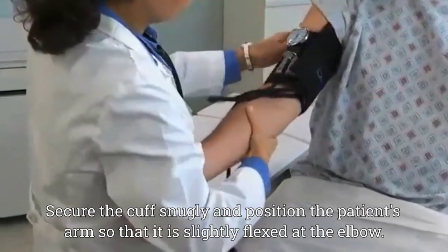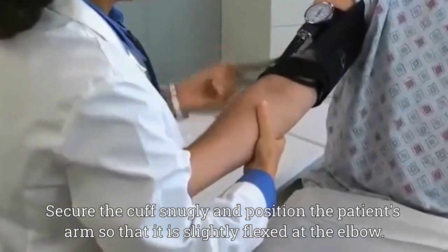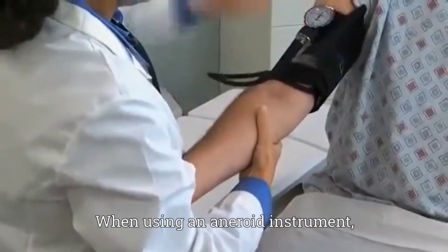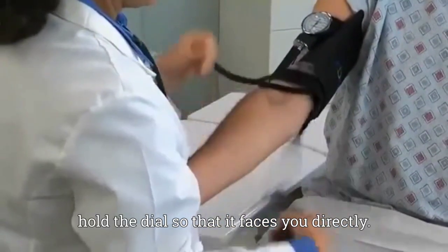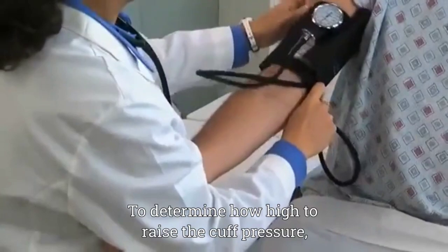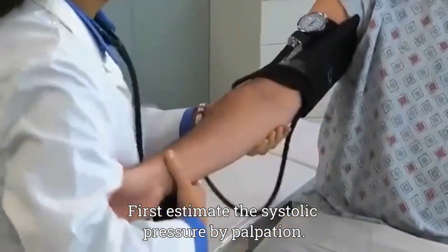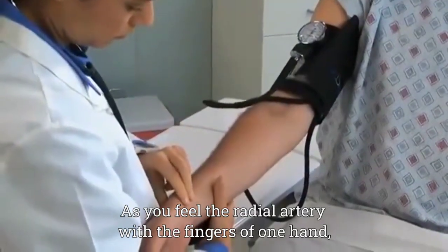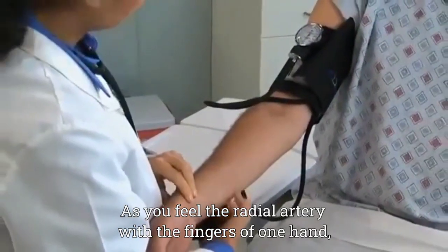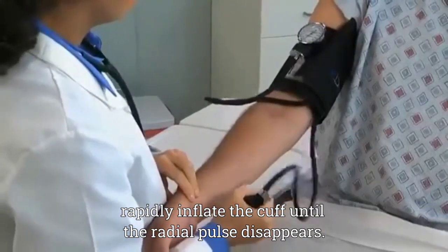Secure the cuff snugly and position the patient's arm so that it is slightly flexed at the elbow. When using an aneroid instrument, hold the dial so that it faces you directly. To determine how high to raise the cuff pressure, first estimate the systolic pressure by palpation. As you feel the radial artery with the fingers of one hand, rapidly inflate the cuff until the radial pulse disappears.